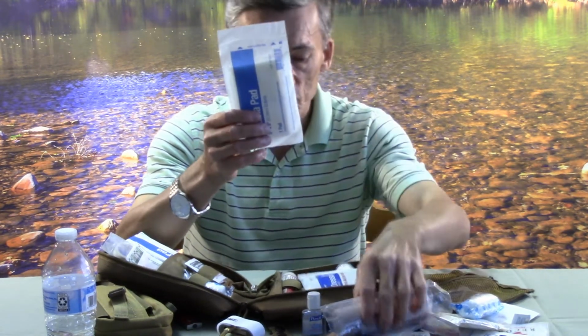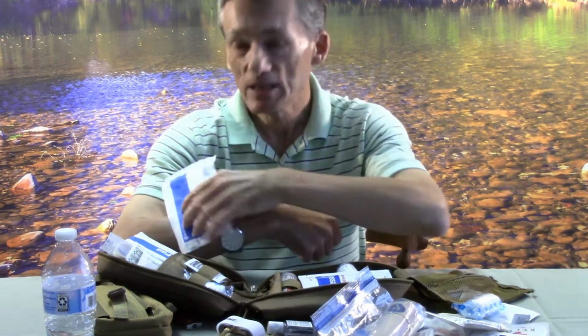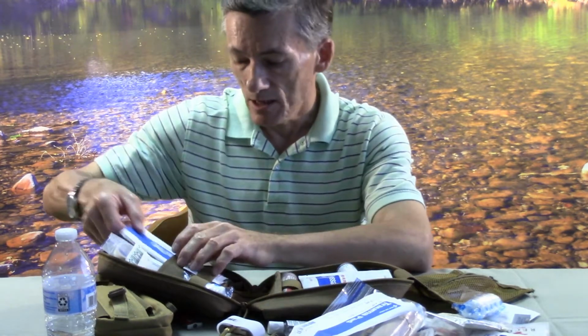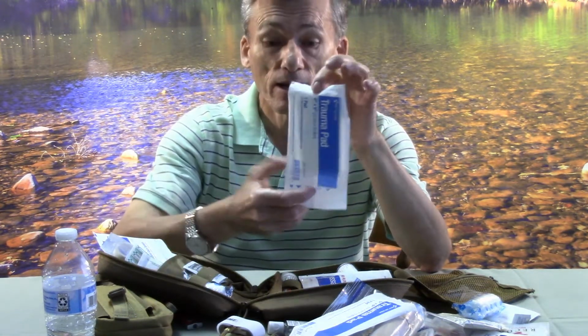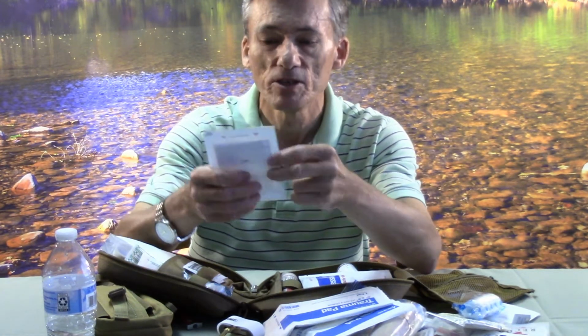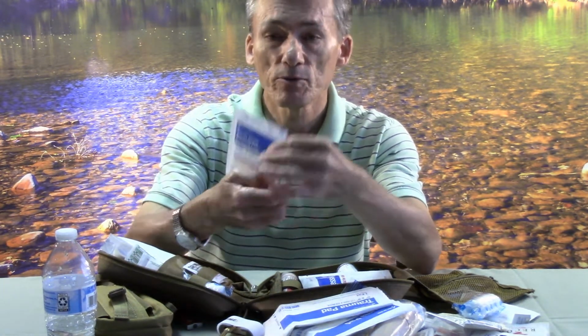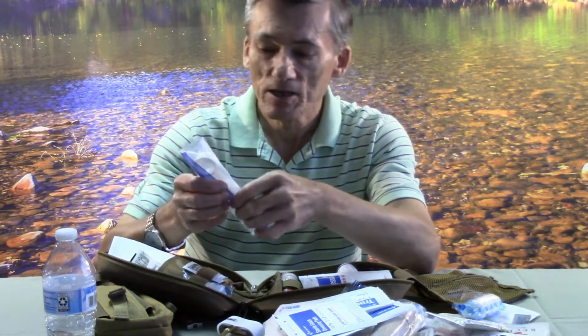And generally, what you're going to do, you might wrap some of this gauze around it, keep it in place. And I've got 2 of those. These are pretty good size ones, by the way. These are 5x9s. I think that's a good size, but also got some smaller ones here. These are 3x3s, 12 ply. You know, I don't have to get into any details about those things.